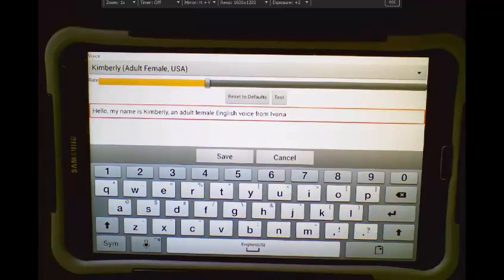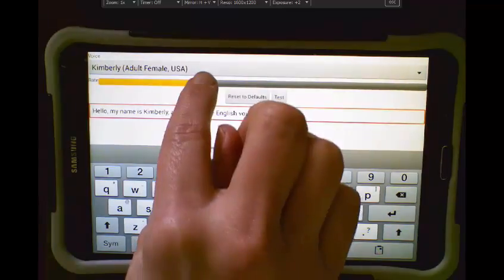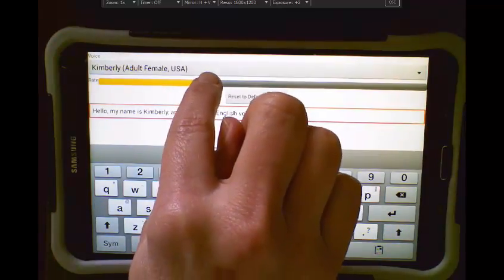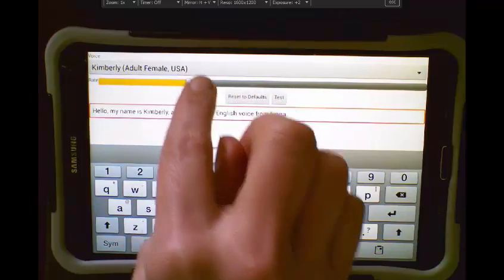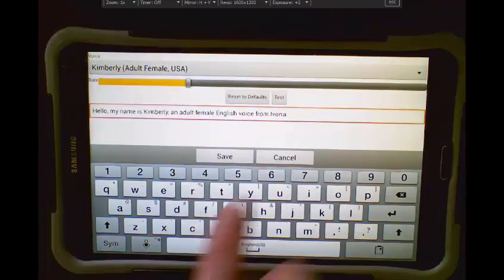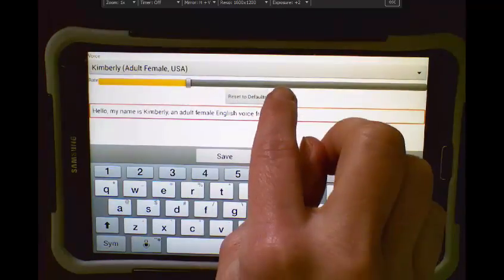Hello, my name is Kimberly, an adult female English voice from Ivona. If I slide the bar back, I can slow that down, and let's test it again.